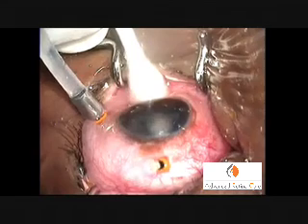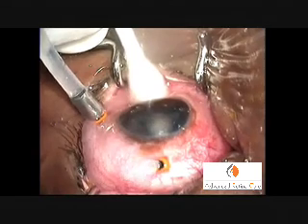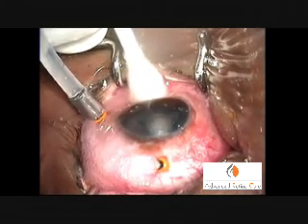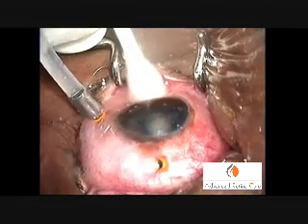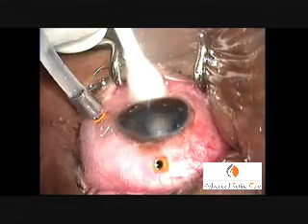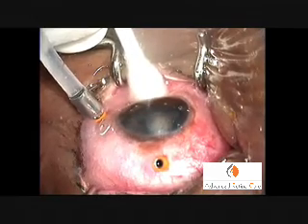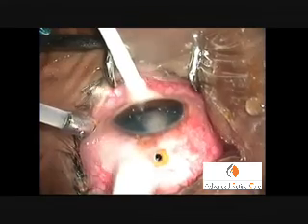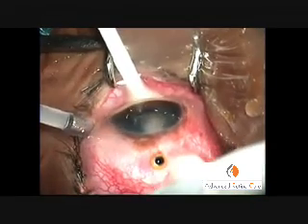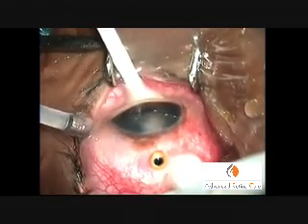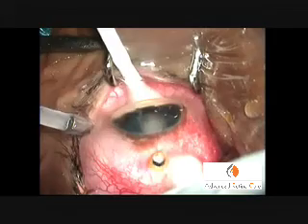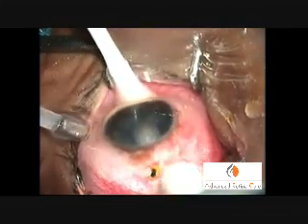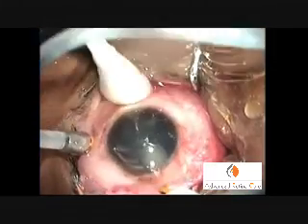A cotton-tipped applicator may be used to gently tilt the globe downwards so the oil flows upwards and out. In this procedure, no active aspiration is required. The oil coming out from the port may be gently wiped away with cotton swabs.